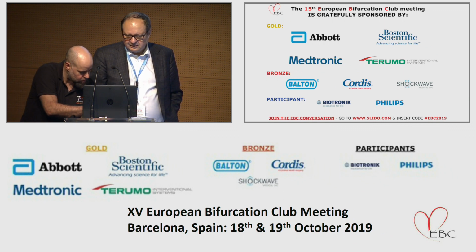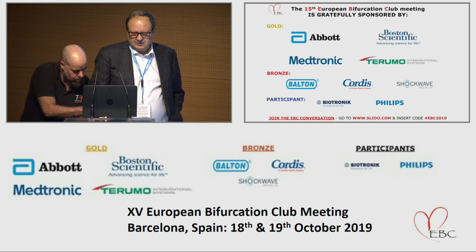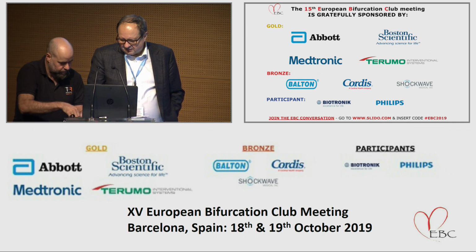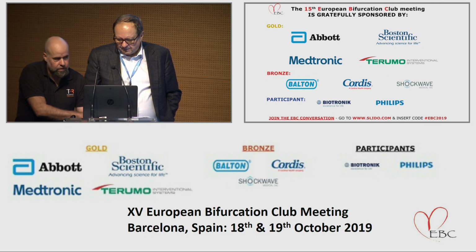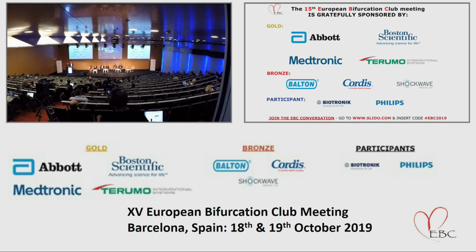This is the purpose of DK crush or other improved crush techniques. I presented already one year ago, and yesterday a presentation here at EBC, showing proximal side optimization. It makes you pull out the delivery of the side branch stent, inflate at higher pressure, and go there with a bigger high-pressure balloon. When you optimize the apposition of the side branch stent at the ostium of the side branch, then it's easier to recross, and you have a better result there. Yes, it was the purpose of DK crush, but of course there are other approaches like your approach.